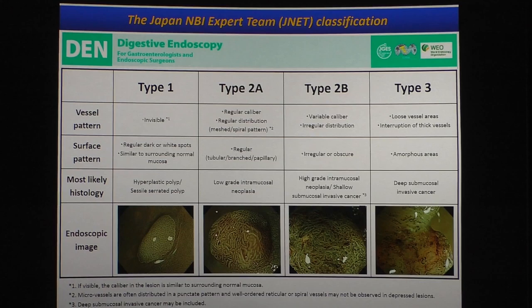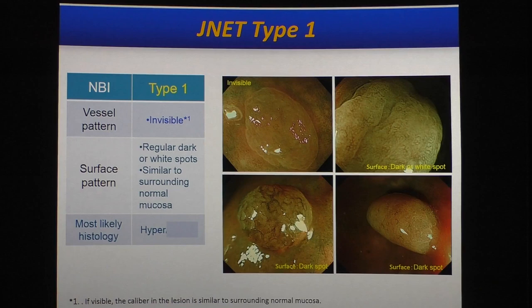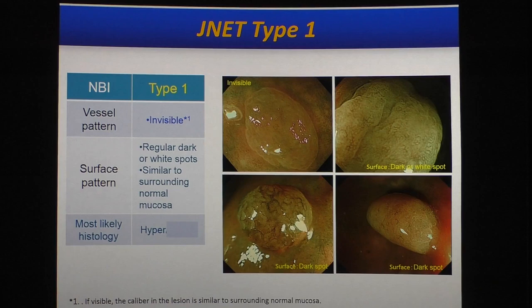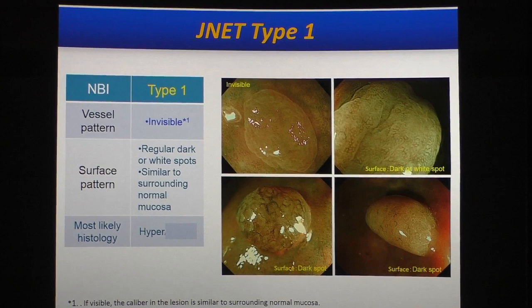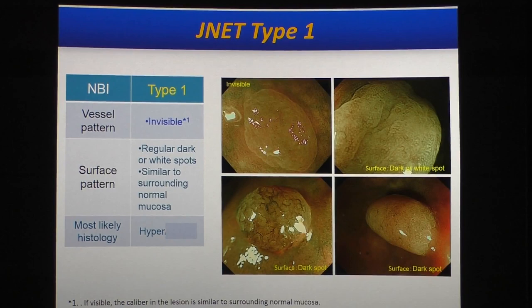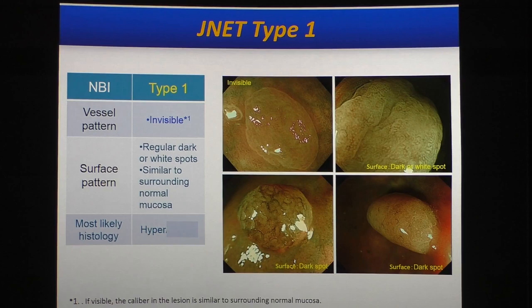From the next slide, let me explain each subgroup. First, type 1: if no clear visible vessels are observed in the lesion and the surface pattern is regular — regular meaning regular dark spots or white spots are observed — in that case, the lesion is diagnosed as JNET type 1, indicating a non-neoplastic lesion, usually a hyperplastic lesion.